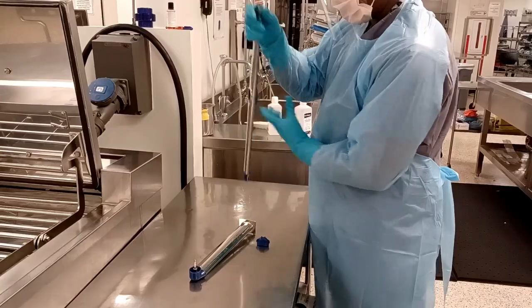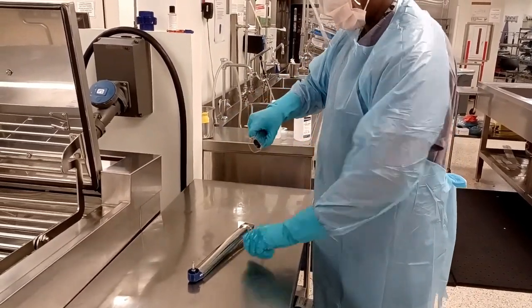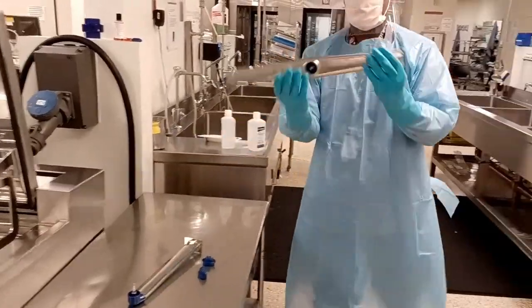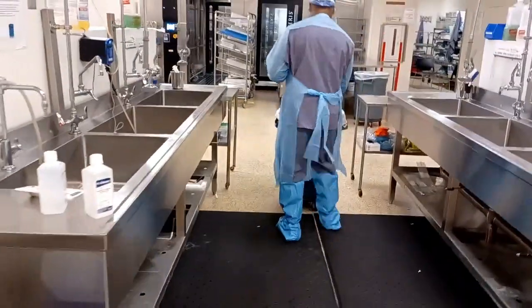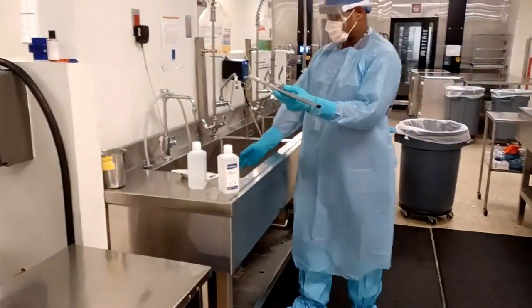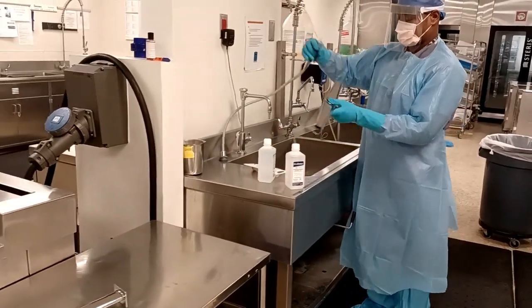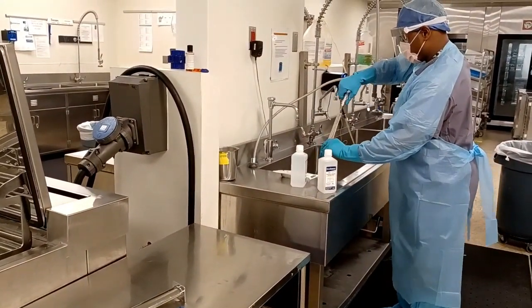It is important to repeat this step to check the spray arms on every washer rack. This will allow the correct dispersal of enzymatic, detergent, and water to rinse the instruments throughout their wash cycle.